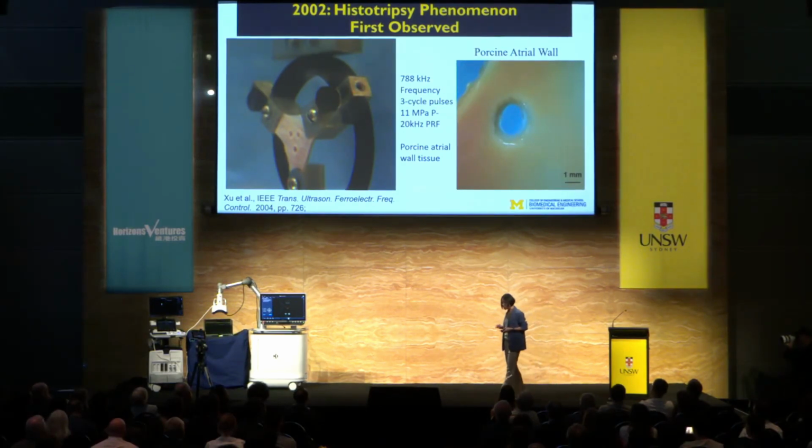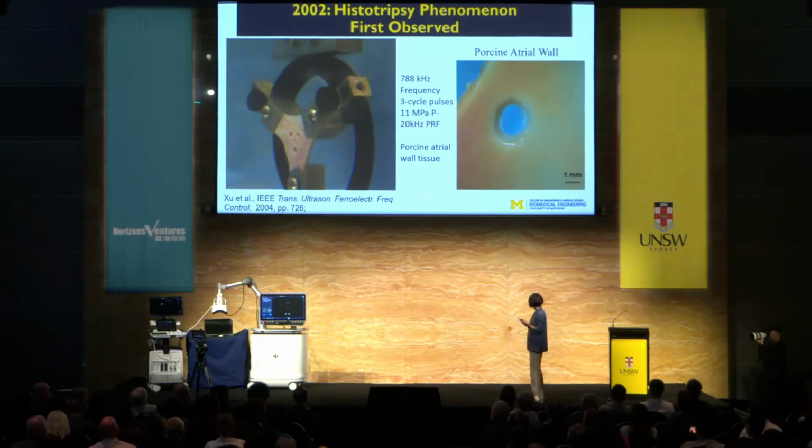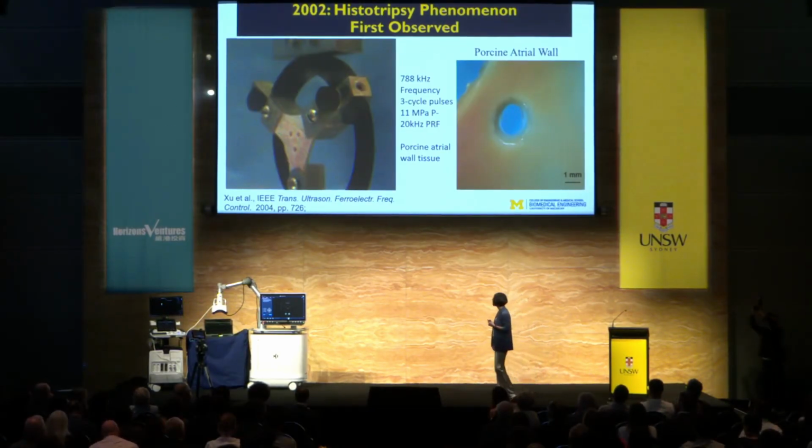So what happens here is that it was the first time I witnessed that using ultrasound with microsecond-length pulses at really high pressure allowed me to break up tissue into submicron-size debris. That's why it looked like smoke. And again, a minute later, I see a perforation. Sound is not touching here, okay? So I can tell you that when I did it the first time, I thought I was dreaming.